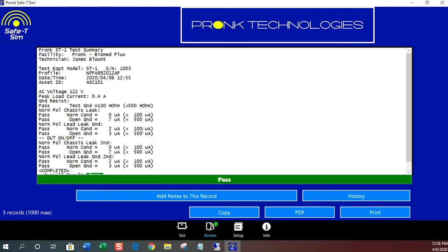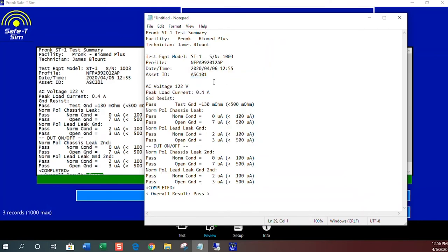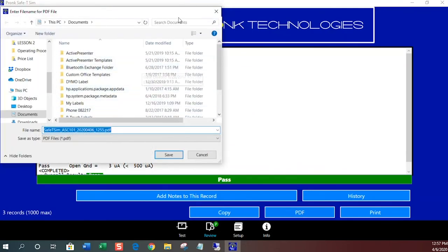Upon completion, your test results will be displayed where you can copy and paste into a notepad document or directly into your PM report. You can also create a PDF document if you'd like.